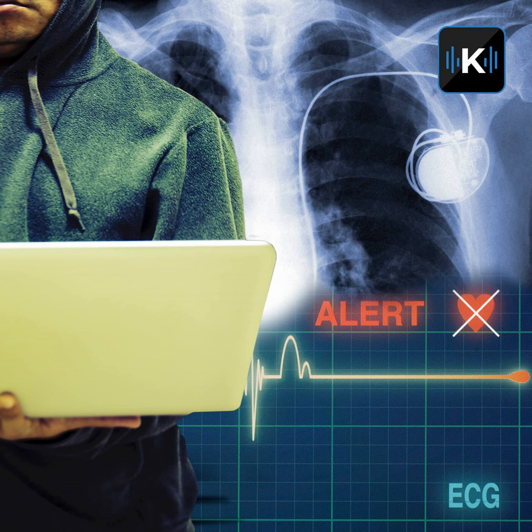We were treating a patient for AFib, and we used cardizem, and all of a sudden the entire bag emptied, and he went hypotensive bradycardic, and then he coded. What happened in that reenactment? Why did the patient die so suddenly?